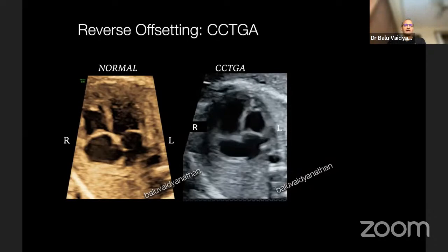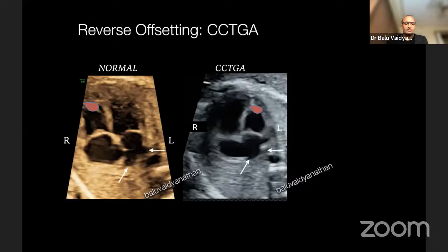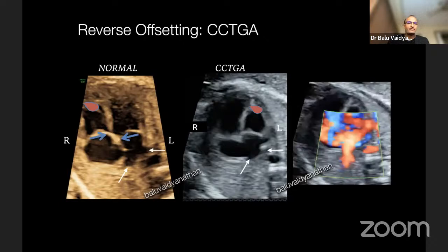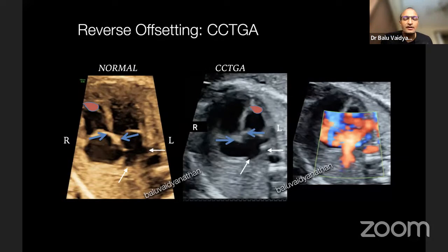The pulmonary veins are draining into the left-sided atrium, but there is atrioventricular discordance. In CCTGA, the tricuspid valve is left-sided and the mitral valve is right-sided. Normally the right ventricle is right-sided, but here the right ventricle is left-sided. Normally you find the offsetting with the tricuspid valve at the lower level on the right side, but here you see reverse offsetting — the right-sided valve is at a higher level, the left-sided valve at a lower level. The atria are normal here — the LA receives pulmonary veins — but the AV valves have become reversed. That is why the mitral valve is at a higher level and the ventricles are also reversed. This is atrioventricular discordance found in CCTGA.